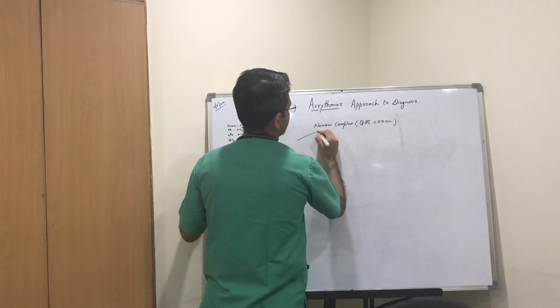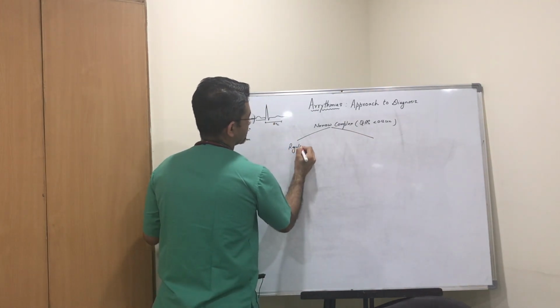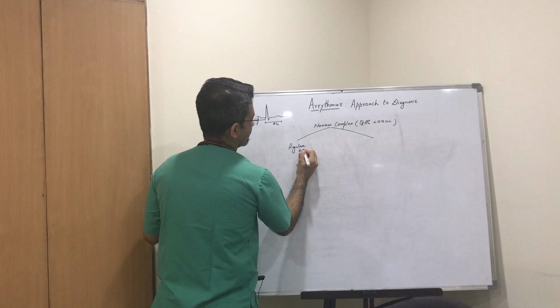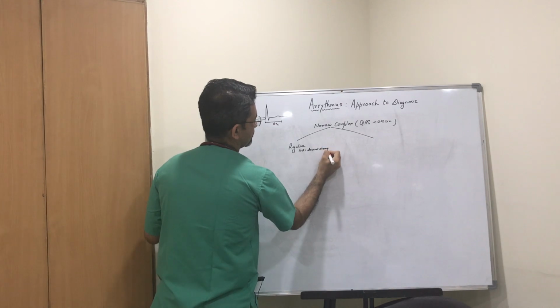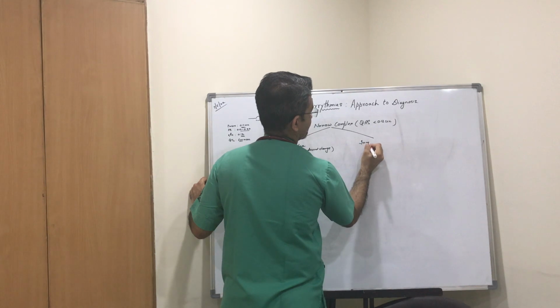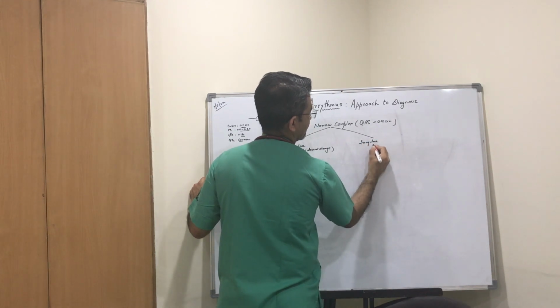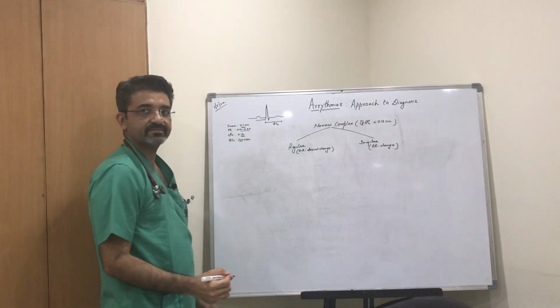It can be regular, that is your RR interval does not change, or it is irregular, that is RR interval changes, right?